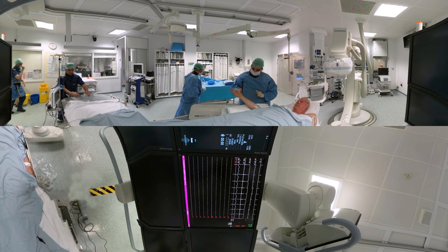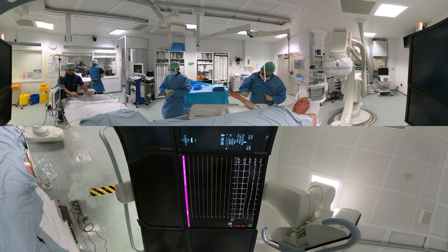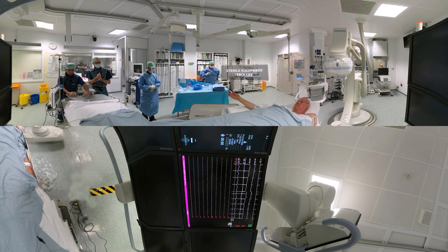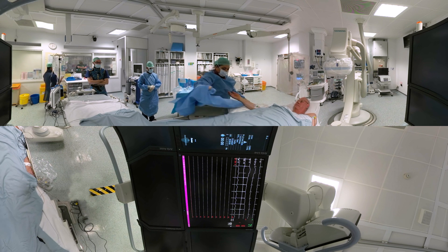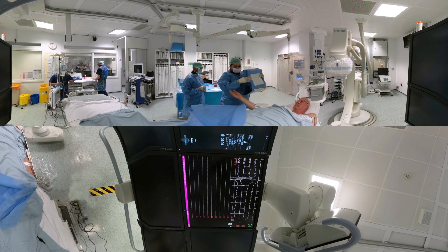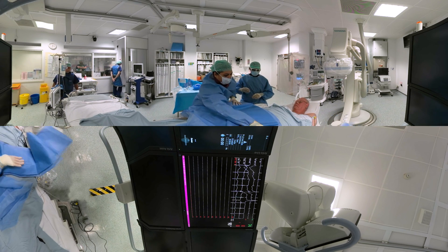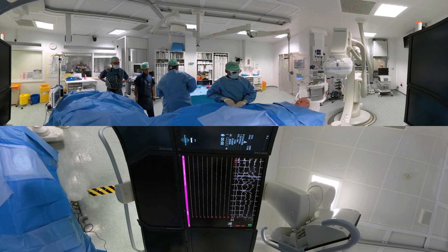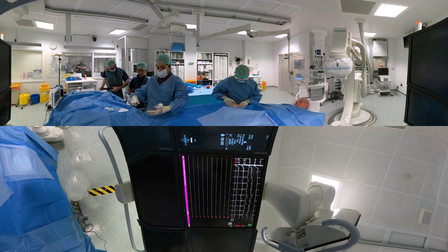The next thing that happens is that we need to drape the patient and clean the access point. In this case we're going in through the wrist artery. About 80% of cases are done through the wrist. Occasionally we need to go through the groin — those are usually planned procedures or where there's some difficulty going through the wrist. The scrub nurse prepares the patient and also the trolley that we use for the procedure. These drapes just keep everything nice and clean.